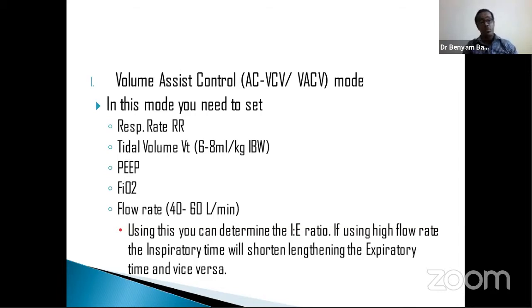The first mode I want to discuss in this part is volume assisted control, or AC-VCV mode, or VACV mode, which means the same. In this mode, we need to set the respiratory rate, the tidal volume based on the predicted or ideal body weight, and the PEEP, FiO2, that is the fraction of inspired oxygen, and the flow rate.